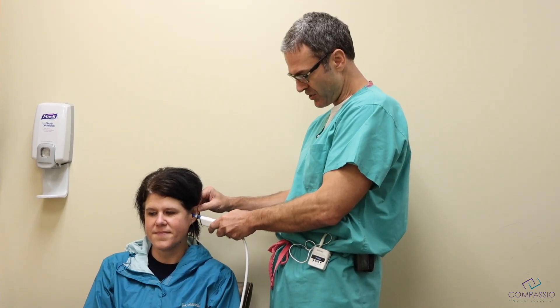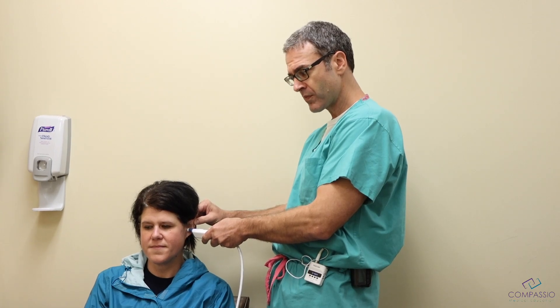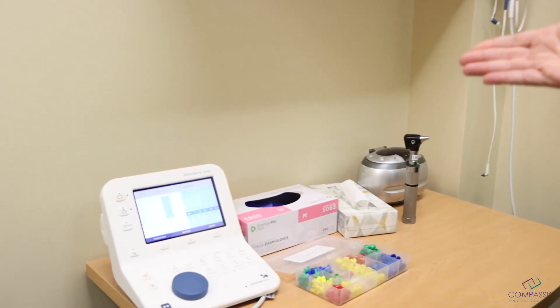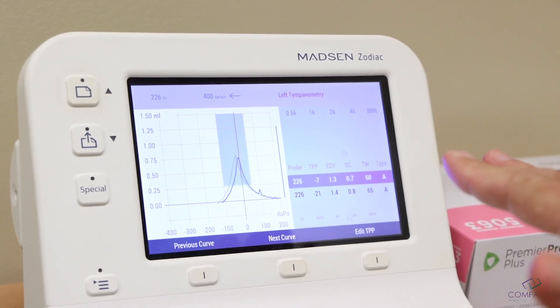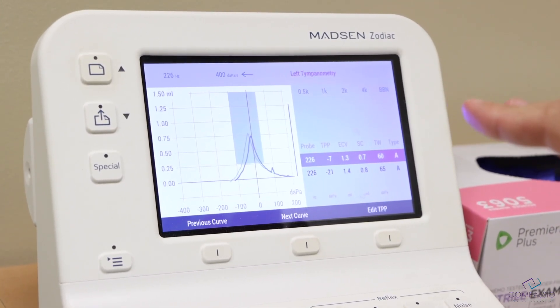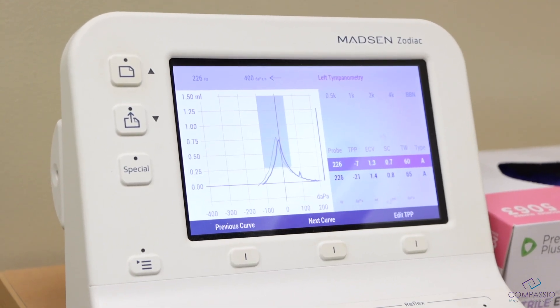I'm going to go ahead and insert — and you see how quick that was. If you look over here now, you can see that our eardrum moved well, and this is a Type A tympanogram. We'll talk about this in a bit, but this is a perfectly normal eardrum — no fluid, no hole, and no retraction.